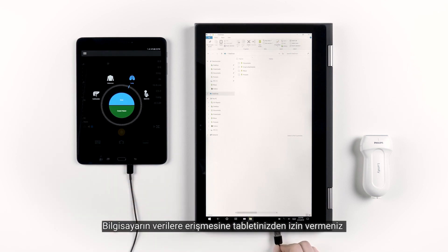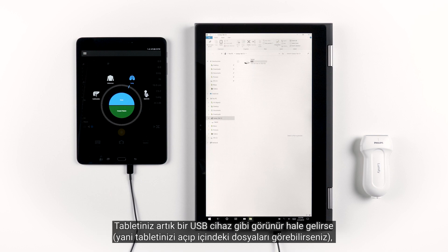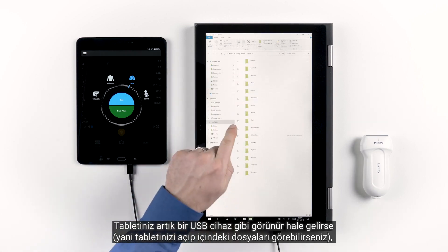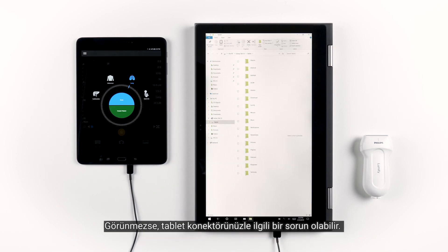You may need to give permission on your tablet to allow the computer to have data access, and you may need to switch the USB connection type on your tablet from charge only to data transfer. If the tablet now becomes visible like a USB device that you can open and see the files within, then you know that your tablet's data connection is working properly. If that doesn't show up, then there may be an issue with your tablet connector — it may have been damaged.